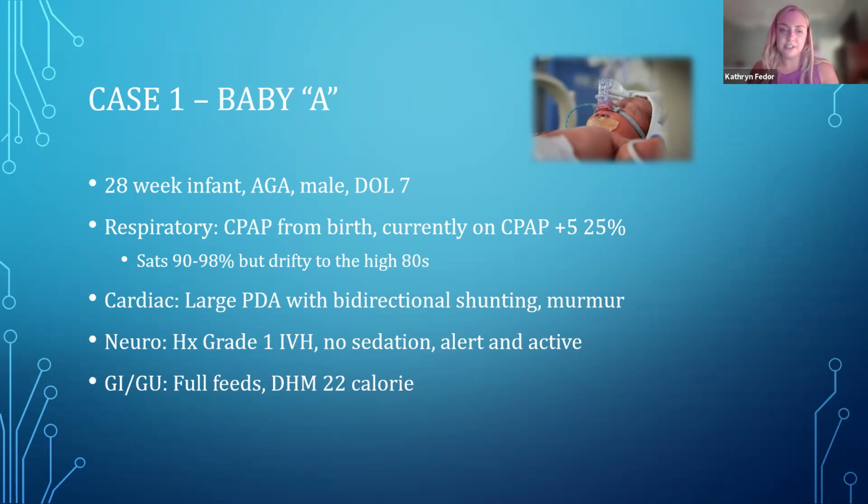And encouraging nurses to really think, we feel like our nurses actually became experts in our NIRS monitoring quicker than some of our physicians did, because they're monitoring constantly and they were able to learn a lot. So what we thought was going to be a very overwhelming thing to introduce to our unit, we found that we have a lot of really good champions for this project that became really interested. And certainly when you see things that you may not be able to catch otherwise if you didn't have this monitor on, it drives home the importance of this monitoring.